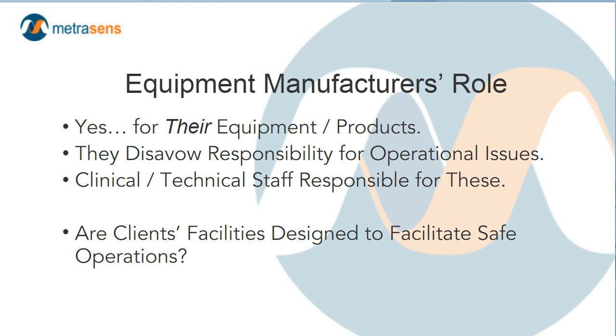But quite frankly, the proportion of MRI accidents that are directly attributable to some sort of malfunction of the MRI equipment is almost immeasurably small. The results that produce injuries, accidents, harm, damage to the equipment, those events are almost always point of care decision-making, operational related issues. So the OEMs, the manufacturers of the equipment, explicitly disavow that responsibility.